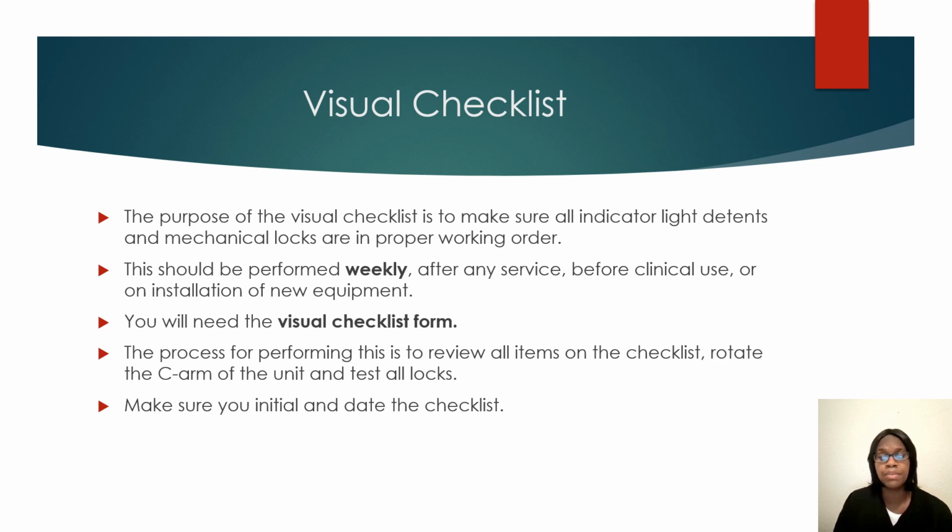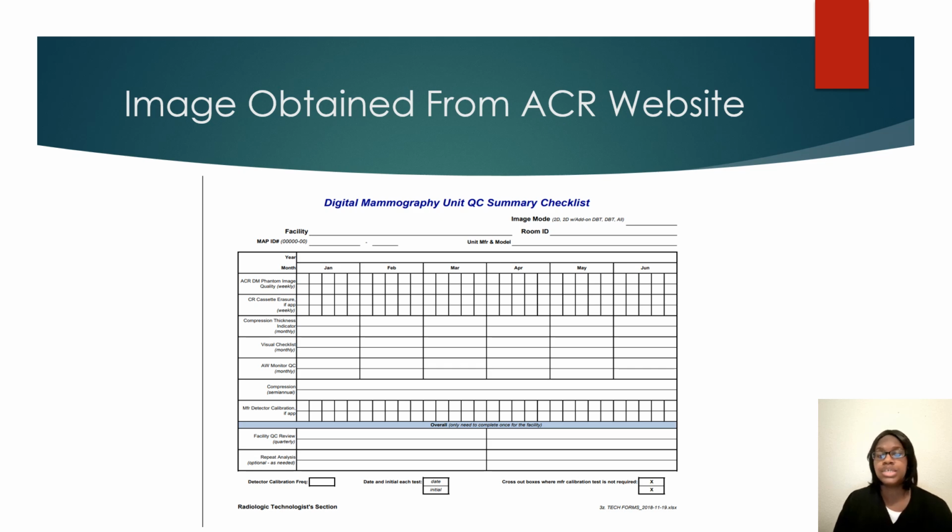That's very, very important. This is just an example obtained from the ACR website of a QC form.